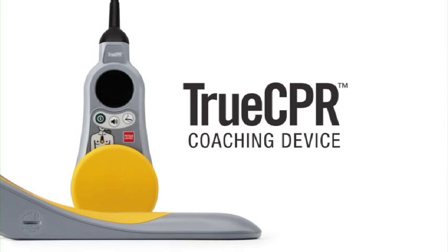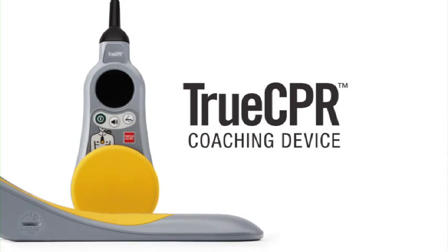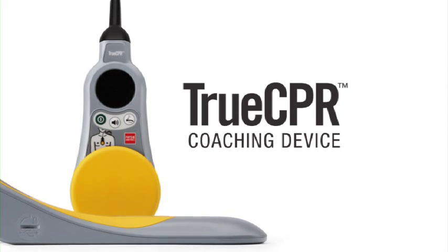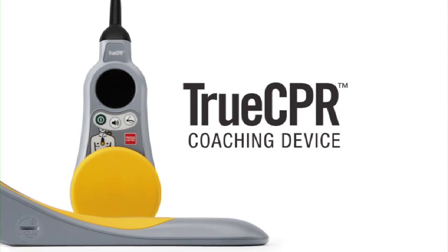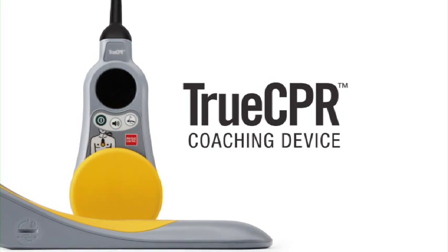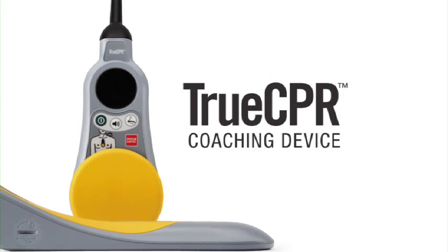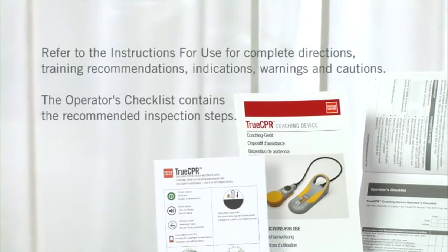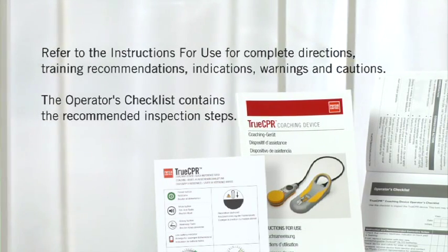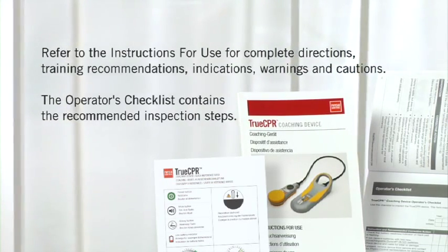TrueCPR from Physiocontrol is a CPR coaching device that provides you with accurate, real-time performance feedback. It is simple to use and enables clinicians at every skill level to focus on the most important task at hand: saving patients' lives with high-quality CPR. We'll go over the basics in this video, but for complete directions, refer to your instructions for use, the operator's checklist, the quick reference card, and your training materials.